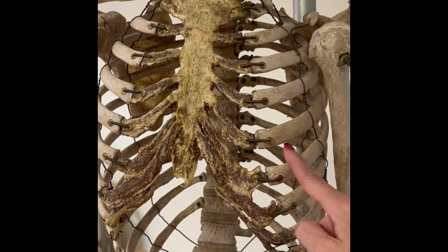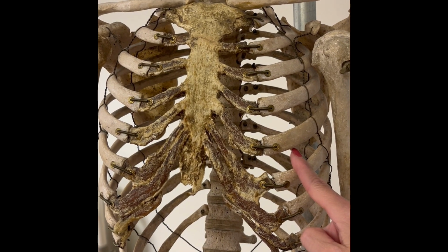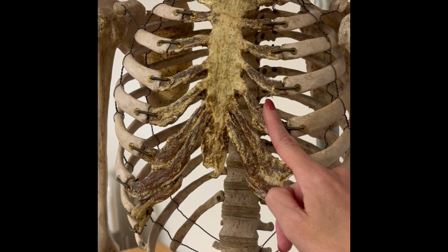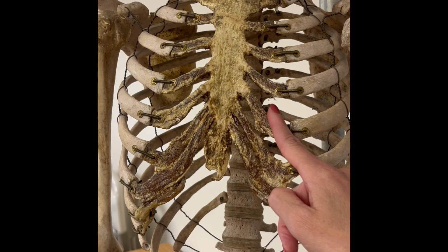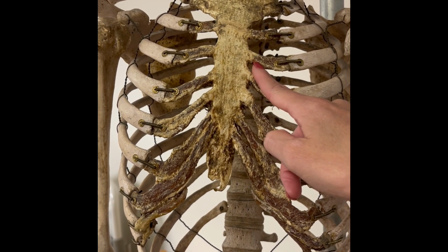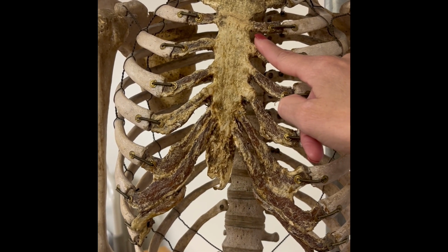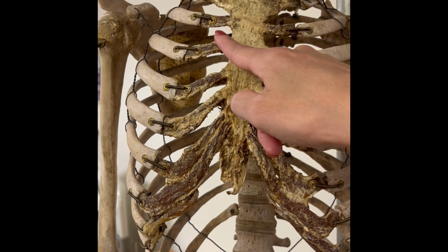After listening to the valves on the way down, you're going to flip your stethoscope over to the bell and come back up. So again, we have the mitral valve at the 5th intercostal space, mid-clavicular line, then moving to the 4th intercostal space, slightly moving back towards the sternum for the tricuspid valve, then at the sternal border in the 3rd intercostal space for Erb's point, then into the 2nd intercostal space for the pulmonic valve, and then across the sternum to the aortic valve.